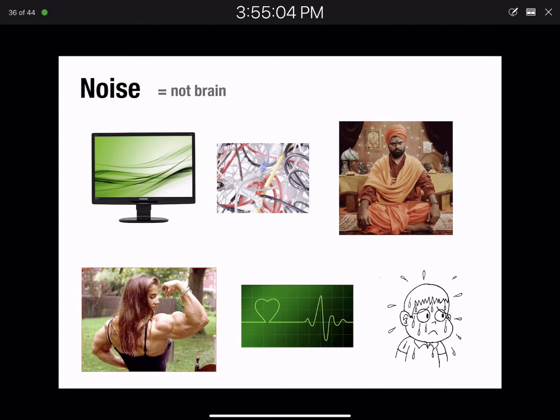The bigger issue with head movement is that, again, this right-hand rule, if we start moving an electrical conductor like the wires that are carrying these EEG signals to the amplifier, if we move them through a magnetic field, which is basically any environment that you're in where you're near electronic devices, they're radiating out these magnetic fields. So if you're moving the conductors through those fields, you're going to induce currents in those conductors. And so you're going to get all these extra currents in the wires just because the wires are moving around in the environment. So that can be a problem.